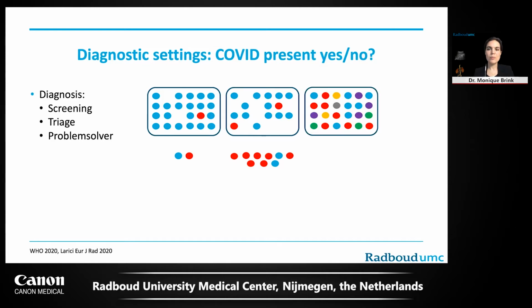And you finally have the problem solver situation, which means that you use CT at the end of the diagnostic process, after you have done your PCR tests or other lab tests or physical examination, etc., and you are left with the complex patients, potentially the patients with a false negative PCR, such as in our first patient, or patients who actually have something else, but have a clinical problem which seems to be a little bit like COVID-19. And then you use CT as a problem solver tool.